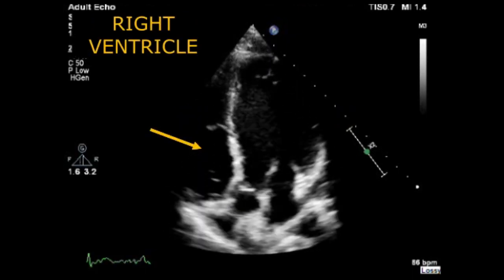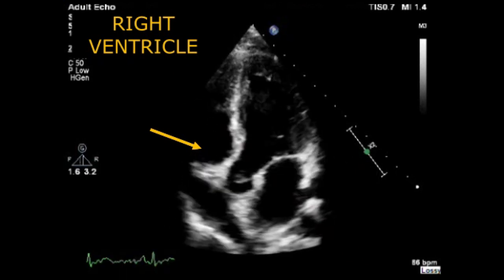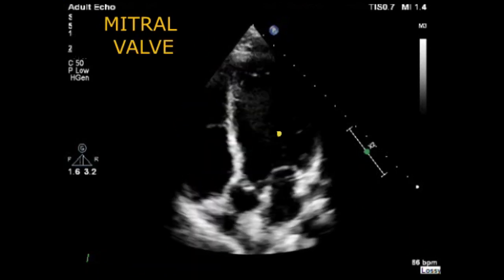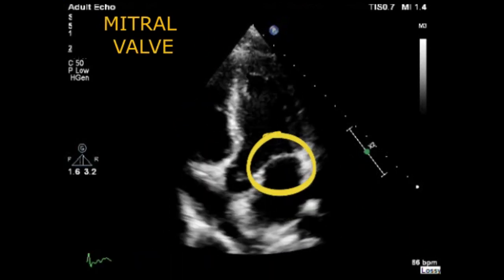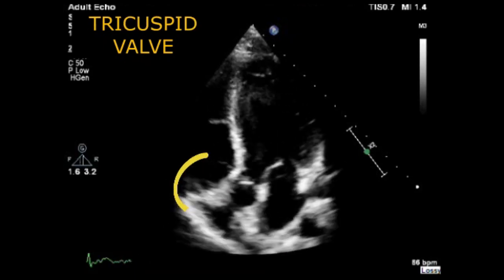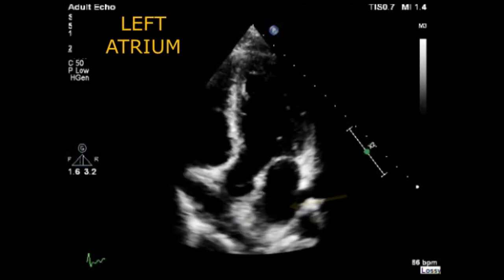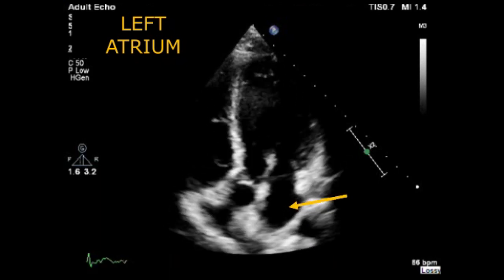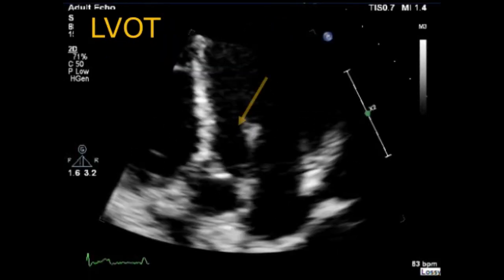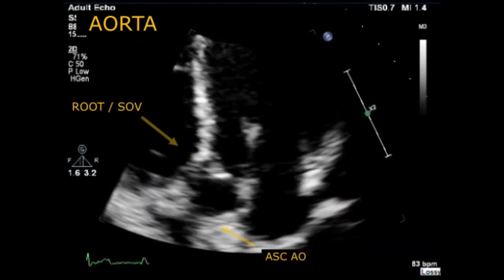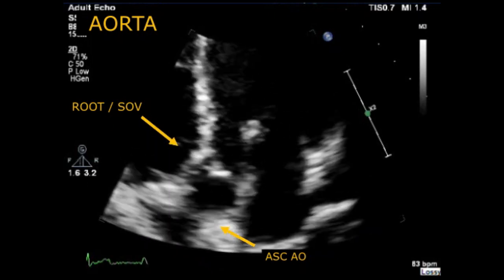Next to the left ventricle, we have the right ventricle and we can also visualize here the right ventricular free wall. Like in the apical 4 chamber view, in the 5 chamber view, we can also visualize the mitral valve on the right hand side and the tricuspid valve on the left hand side. Under the left ventricle, we have the left atrium, and the extra structures visualized here compared with the apical 4 chamber view are the left ventricular outflow tract, the aortic valve, and also the aortic root or sinus of Valsalva and part of the proximal ascending aorta.